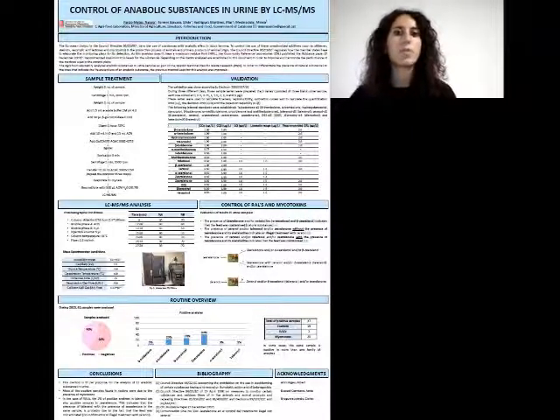With this method, the Agri-Food Laboratory analyzed anabolic substance in urine samples as part of the Spanish National Plan for Residue Research. A total of 62 samples were analyzed this year. In this graphic, as can be seen, 60% of the samples are positive. With more details, this graphic indicates that zearalenone is present in 40% of the samples, and this fact is linked to the ingestion of mycotoxins.